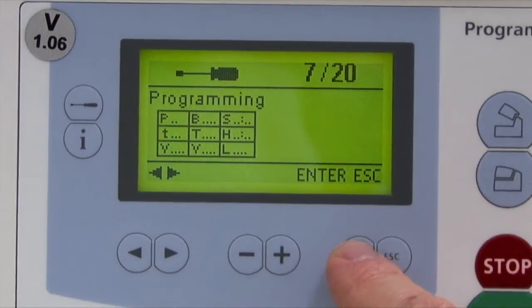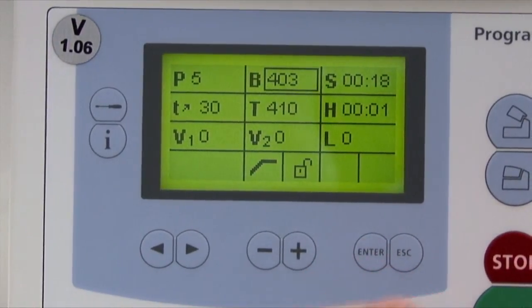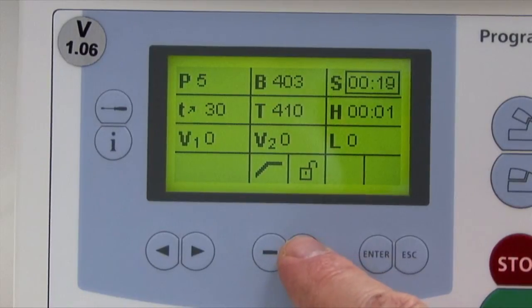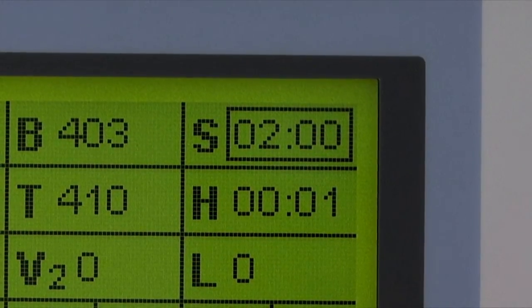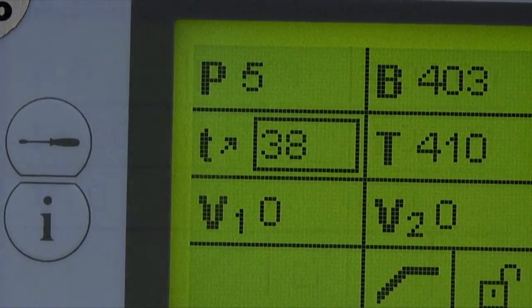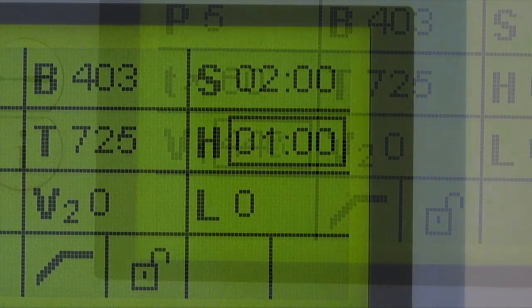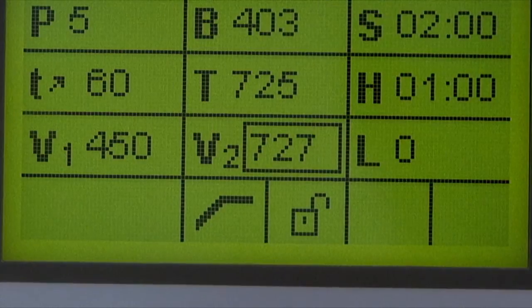In this list, all the program parameters are shown. The desired parameter can be selected by using the cursor keys, and the value changed by using the minus and plus keys. Once the parameters are loaded, this screen can be exited by either selecting the escape key or a program key.